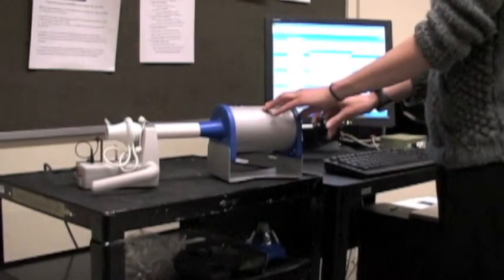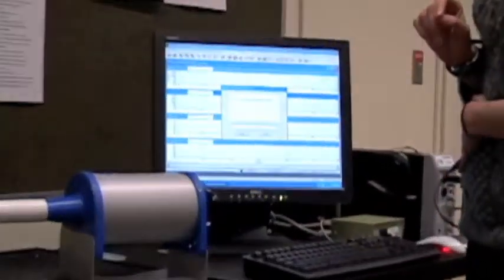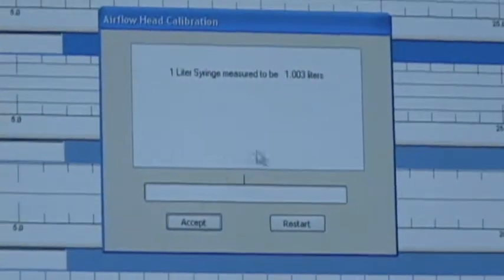One one thousand, two one thousand, three one thousand. You can see the one-liter syringe measured to be 1.003 liters — that means it's good. Press accept. Now the system is calibrated.